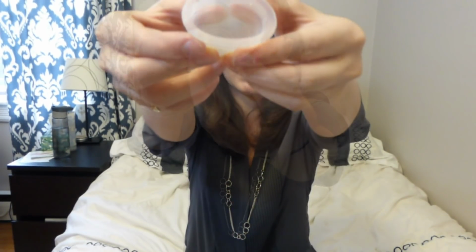As far as how you insert a cup, you just fold it and then you insert it into the vagina, and when you let go, it's going to pop open, and it has this kind of suction action that actually keeps it up there and in place. There are 2 types of folding options. There's the U option, which is the one that I personally do, which kind of looks like a U. You're pushing it down so that it's horizontal and folding it in again. There's another one which I personally have never tried, but in their instructions they talk about the push down fold. You're kind of just pushing down in the middle and squeezing it together so that it's once again a more narrow shape. You can use whatever one is most comfortable for you.